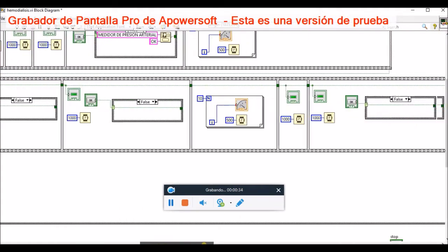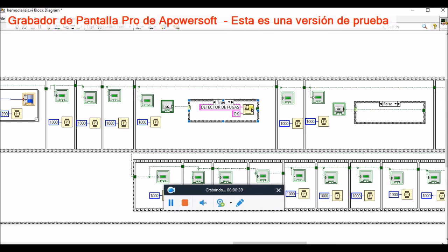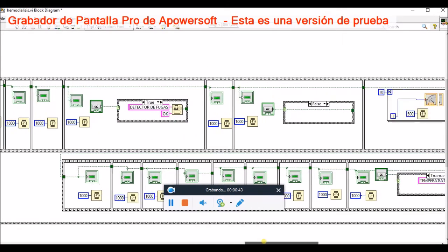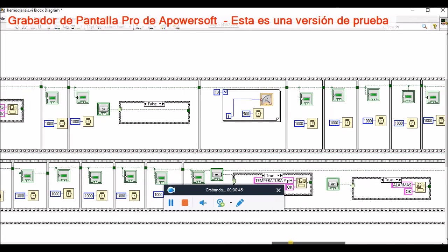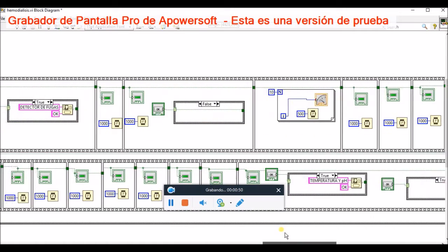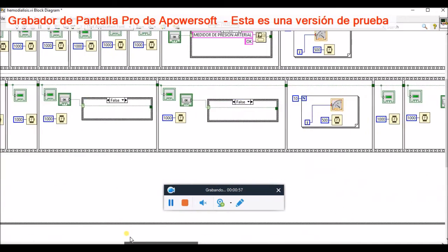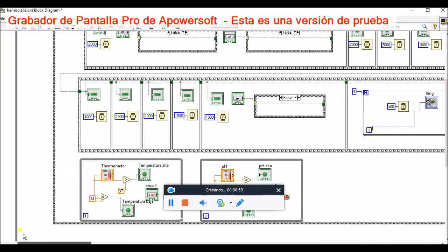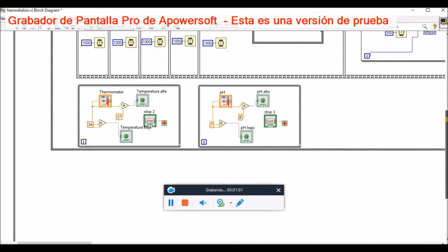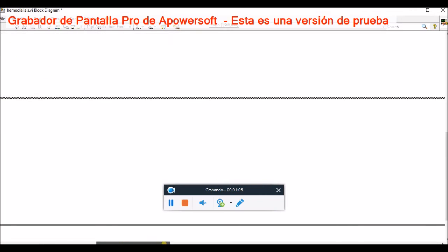The filter receives dialysate from the machine, which has mixed the water and dialysate to the appropriate concentration. After flowing through the filter, the blood goes through the post-membrane pressure sensor and then an air detector. If air is detected in the circuit, the machine will alarm and shut down. If no air is detected, the blood flows back to the patient by the venous catheter limb.